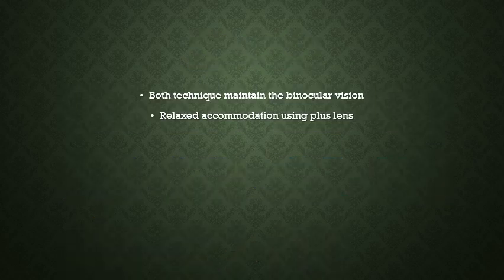So what you can see is both techniques maintain the binocular vision and also relax accommodation by using the plus lenses.